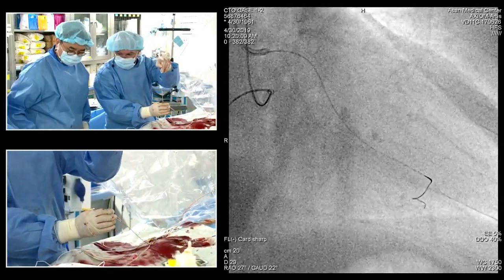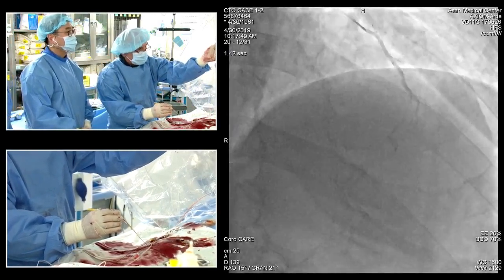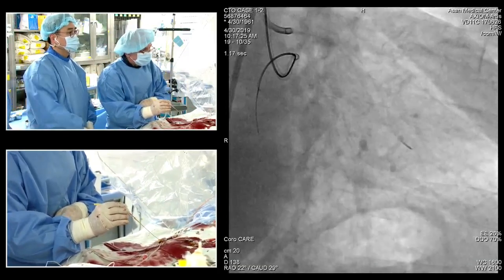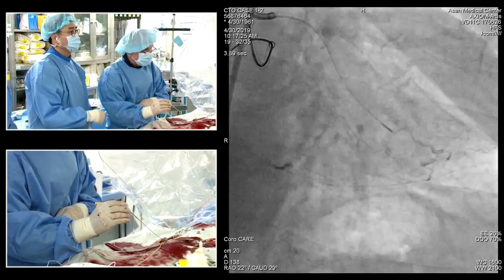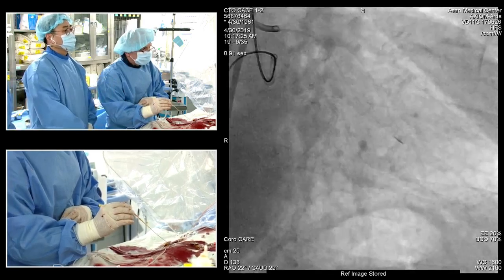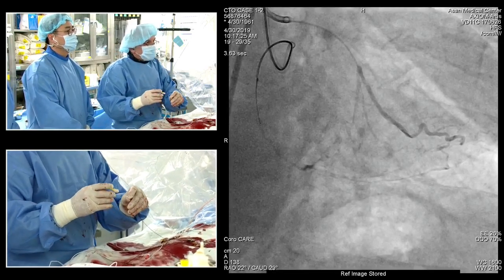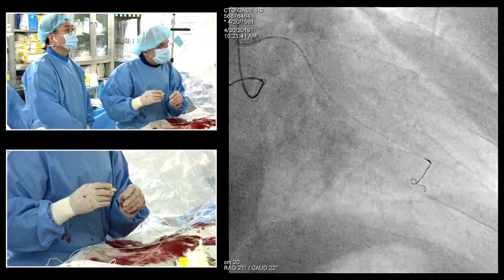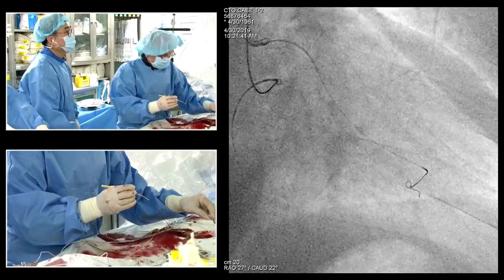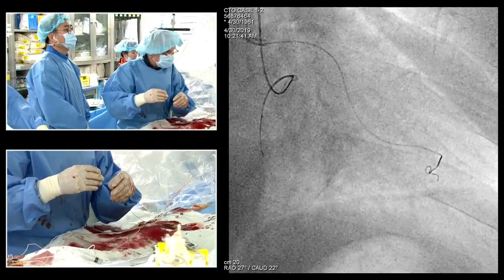Can we go back to the other projection that we had before? No. Go back? Back. Back? Yeah. I'm looking for the road map. Okay. Stop. Back. A little bit better. Store. Okay, I'm certainly in this one, and then it should go down a little bit forward. It's always the risk of advancing the Caravel too much.